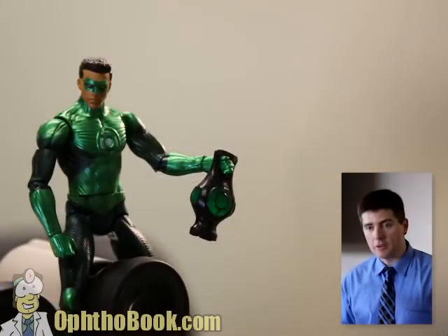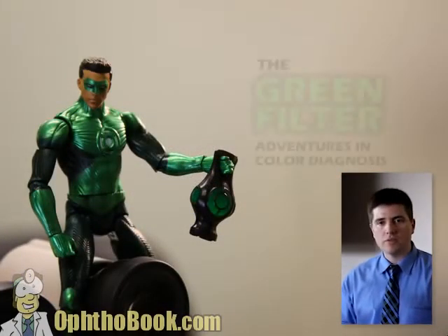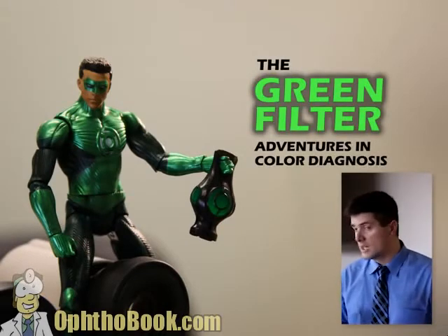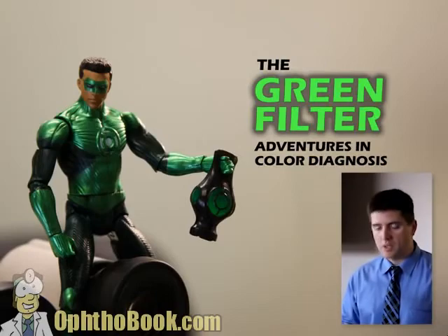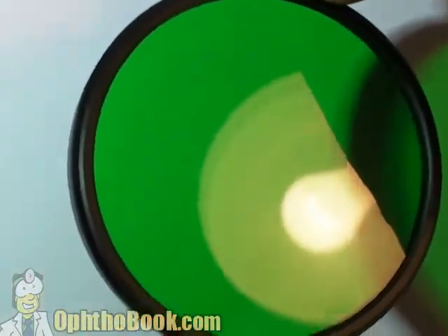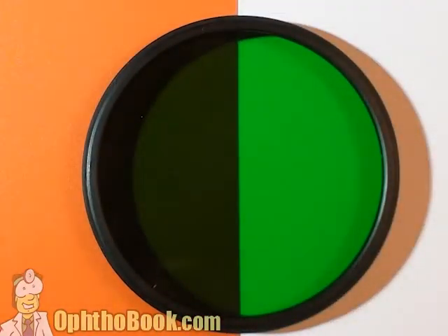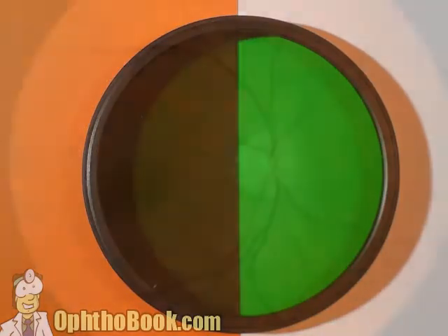Now, we know this superhero, yes? Well, he's going to introduce a filter that you probably don't use very often. This is the green filter. Now, we don't call it the green filter in medicine, we call it the red-free filter, and the reason why is because red light has a hard time passing through it. This is a red sheet, and you can see that red light bouncing off the sheet has a hard time getting through that red-free green filter.